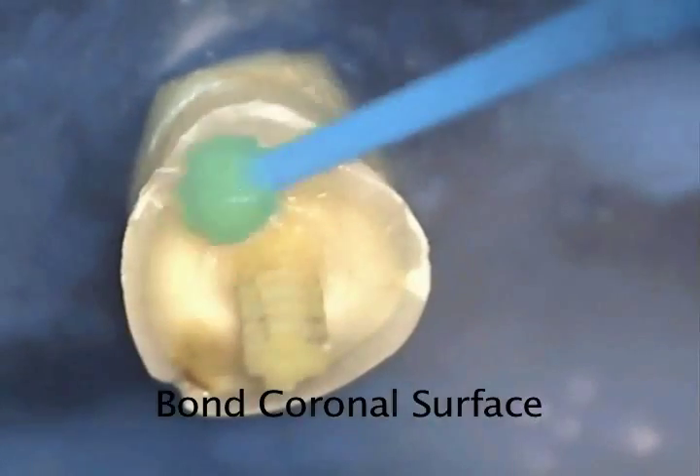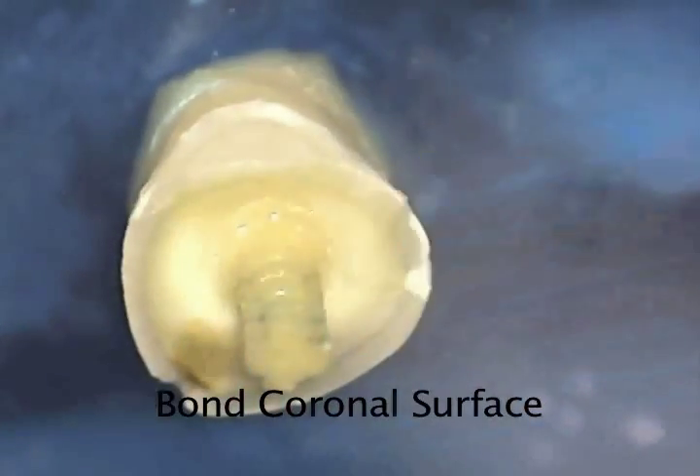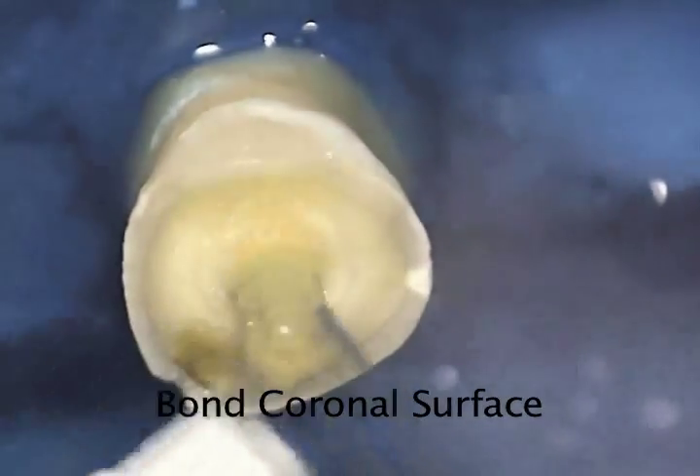Because we are using Dual Cured Tycor Auto-E for the core material, we recommend using a multi-step bonding agent. First, we etch the coronal surface with 37.5% phosphoric acid for 20 seconds and then wash it off with water.